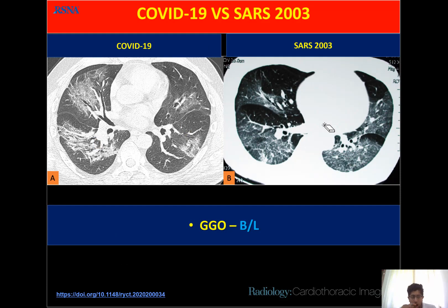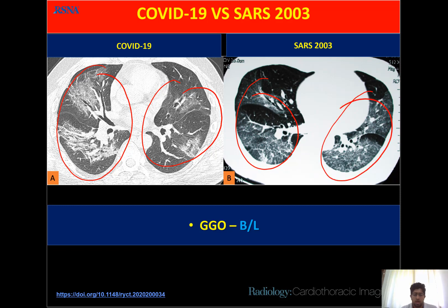COVID-19 has a similar appearance to SARS 2003 — the virus is similar and the imaging findings are comparable, with bilateral ground glass opacities seen in both. To summarize the findings of COVID-19: peripheral involvement, lower zone predominance, ground glass opacity predominantly, consolidation also seen, and rarely nodular or nodular with central necrosis. No pleural effusion, no pericardial effusion, no mediastinal lymphadenopathy, and no sub-pleural sparing.